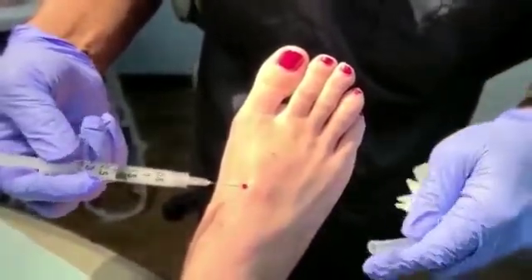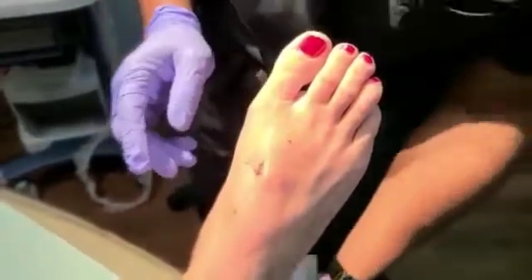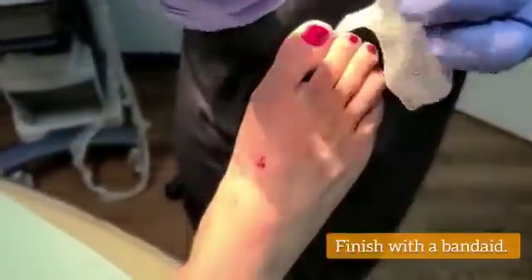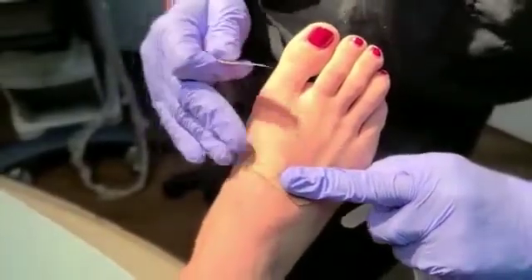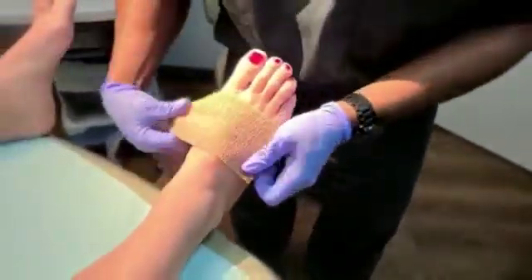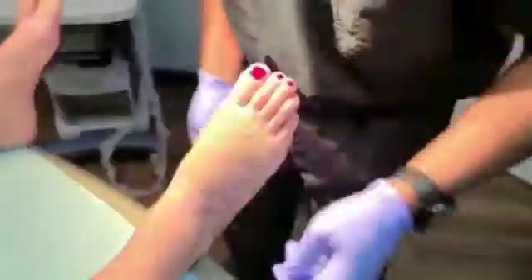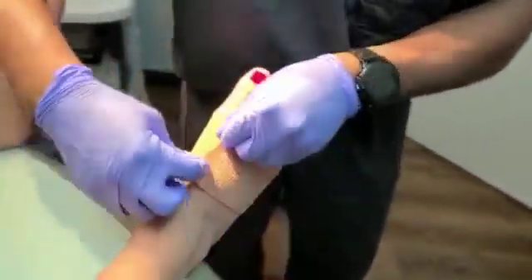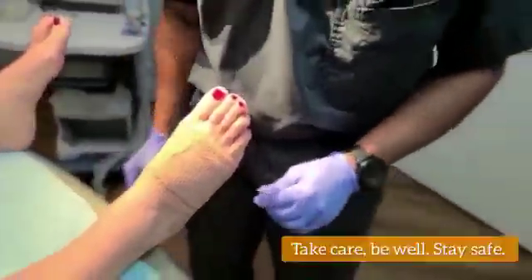After we put a little bit of steroid medication in there, I again clean the area, put a little bit of antibiotic ointment, and a band-aid. You're going to remove the band-aid later on tonight. I'm going to put a little bit of compression around her foot — that's going to help keep this dressing intact and prevent it from getting big again. Ganglion cysts unfortunately do have high recurrence rates, but there are some things we can do to help prevent them from coming back, including this compressive dressing, avoiding shoes with straps that go across the top of the foot, and doing stretches and exercises. Our patient will get more information about that later on.